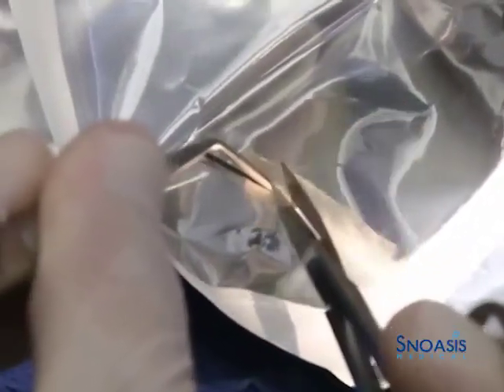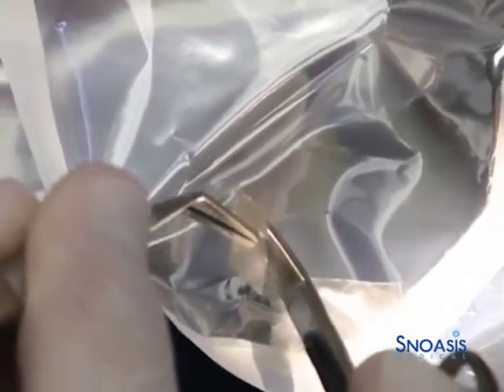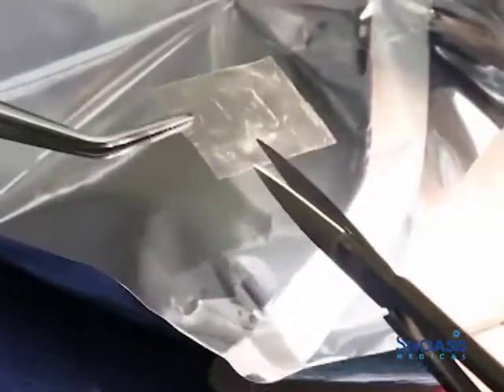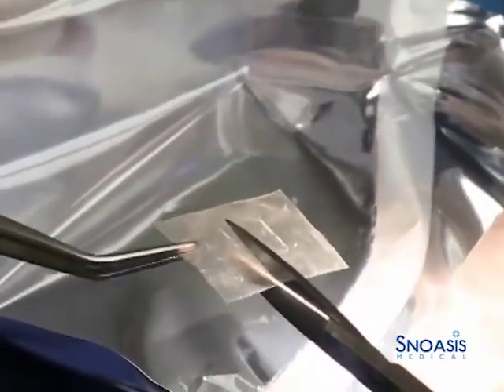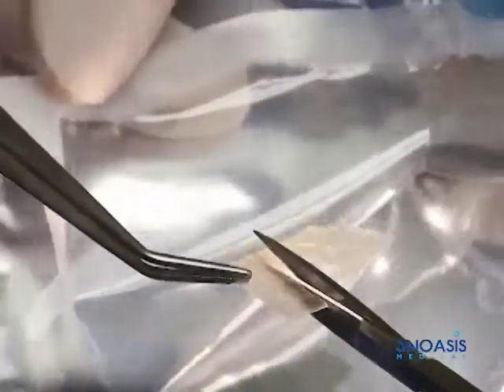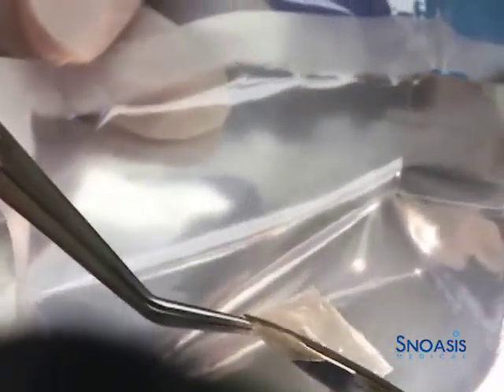Okay, so we're going to go interproximal. What we want, we only need about a piece that big. Let's see, there's one. And there's two. That's going to be about all that we need.